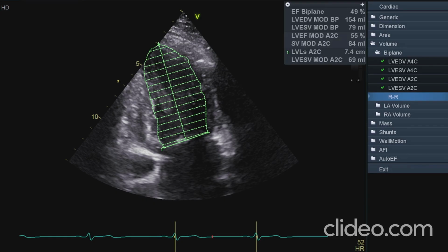So that's giving us a diastolic volume of 154 mils and an ejection fraction of 49, so say 50. I suspect Kim probably does a bit of sport, which is why he's got a borderline low ejection fraction.